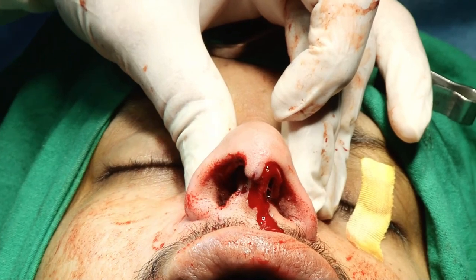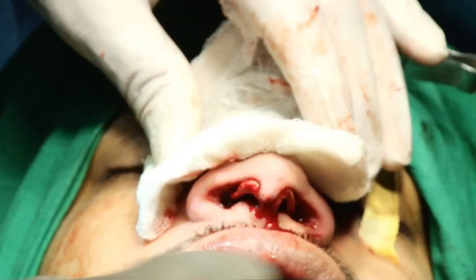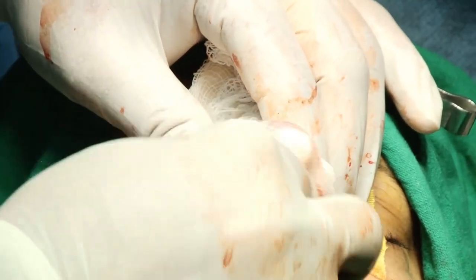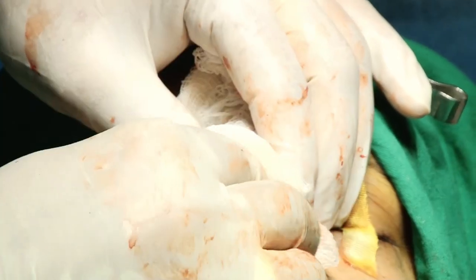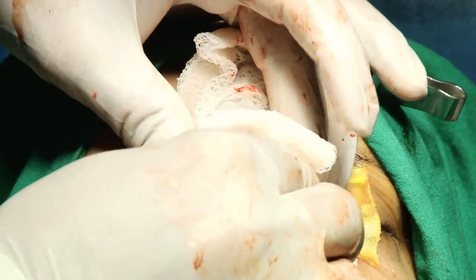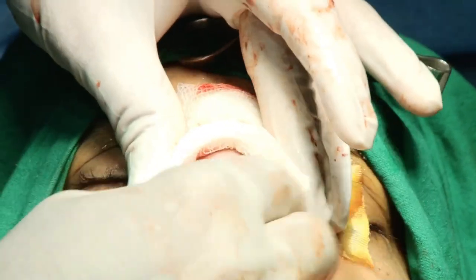That is a very important thing: first you assess your case. It's not necessary that in each and every case you have to use every type of osteotomy. First you realize what anatomical deformity your patient has. Sometimes lateral osteotomy is enough, sometimes there is no need, and sometimes we use a combination of all the osteotomies. So it's basically your judgment and your individual approach.